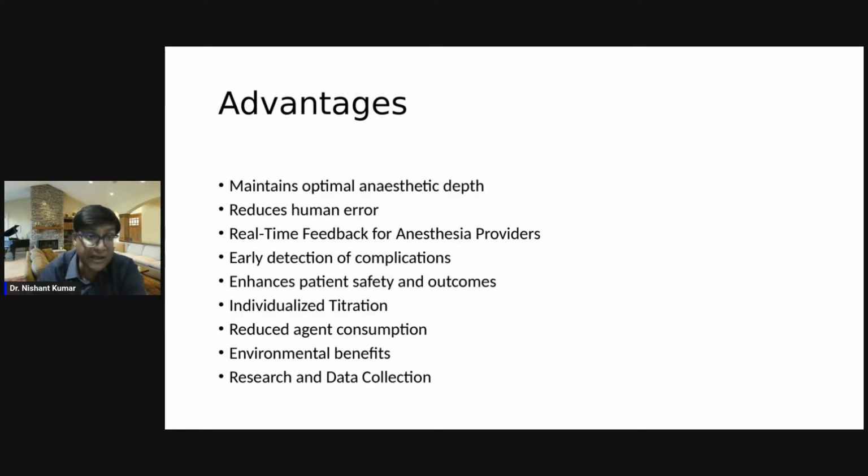You can individualize the drugs and dosages to each patient. Obviously, because if you are using inhalation agents, if you are using TCI, it will be individualized. So the agents, whether it's inhalation or propofol or the analgesic, the requirement is much less. If you are using TIVA TCI, or even inhalation agents with reduced flows, there are environmental benefits.